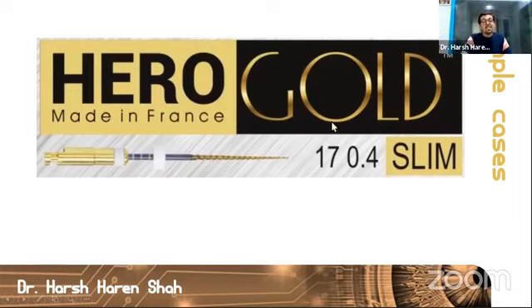So what happens is this file, a 1704, works as my glide path preparation file, but I can only use it in simple cases. I will not use this file for complicated cases. The reason I would use this for simple cases is my work becomes much quicker, because I just need a single file to take me right up to a 17 number instrument.